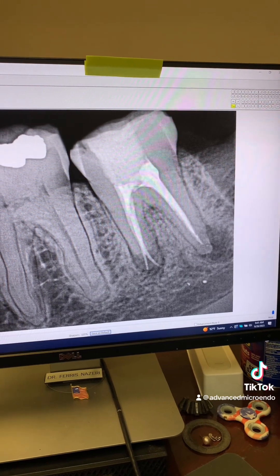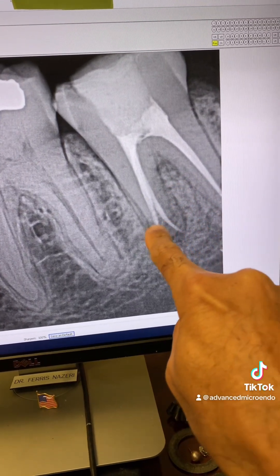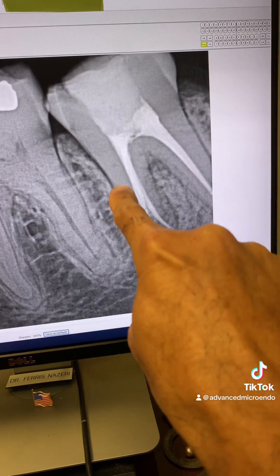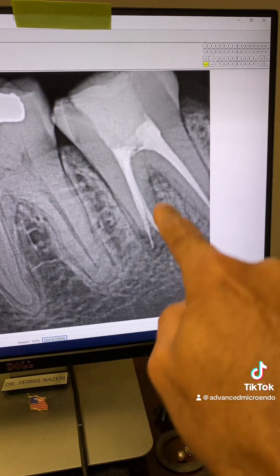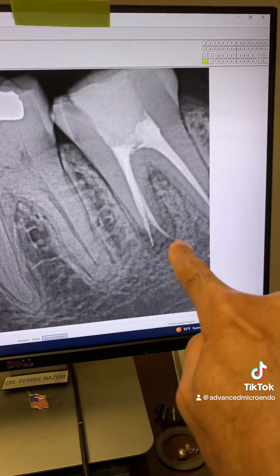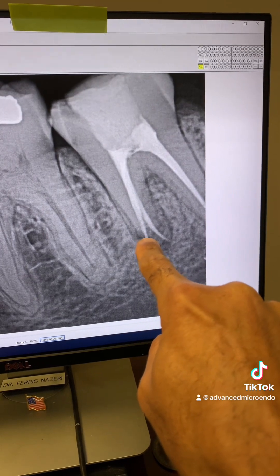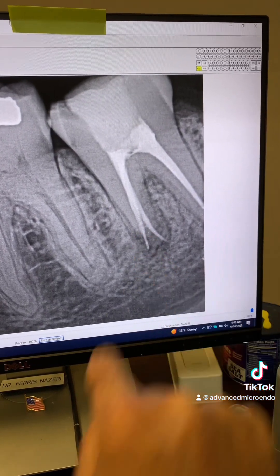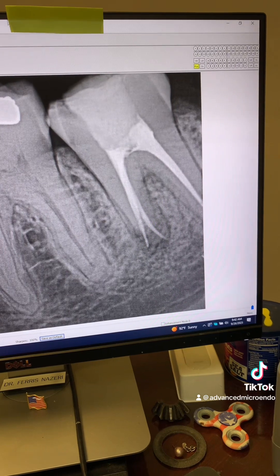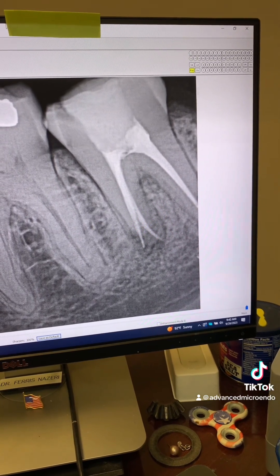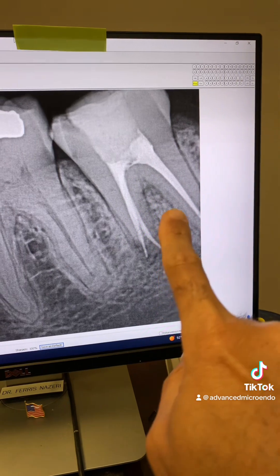Maybe something's happening here as well. Look at this angulation — look at this. This is one of the roots and that's another root. This root here was filled to length; this root here is overfilled — filled beyond the working length of the tooth, as you can see. But I'm doubtful that there's a periapical lucency here; I think the mesials are clean.